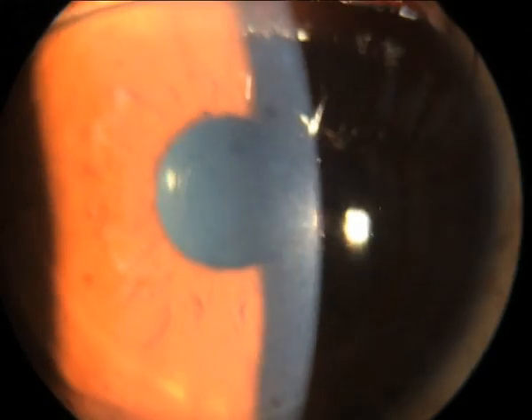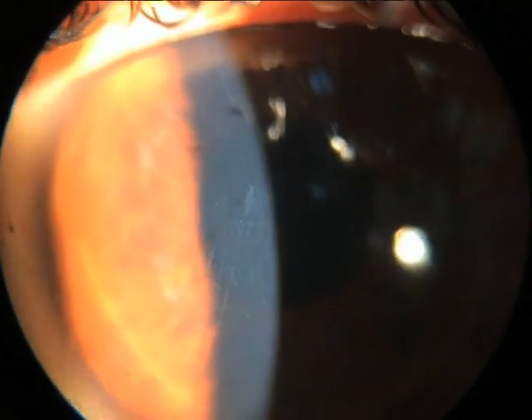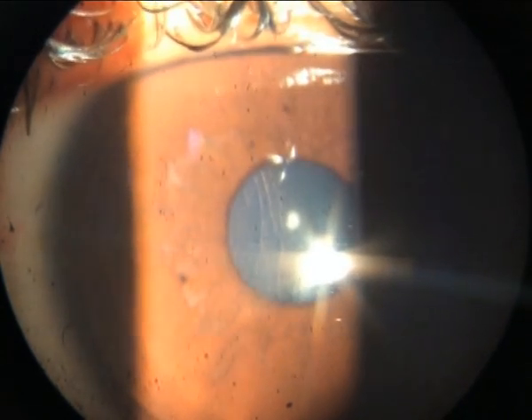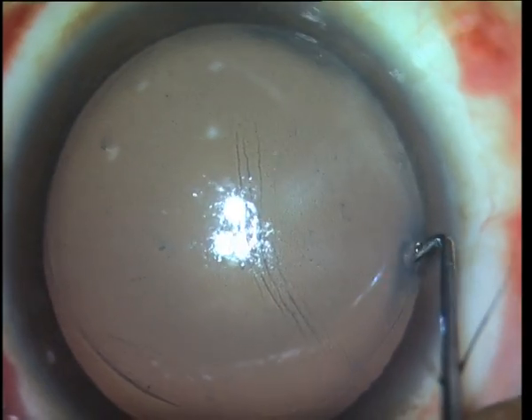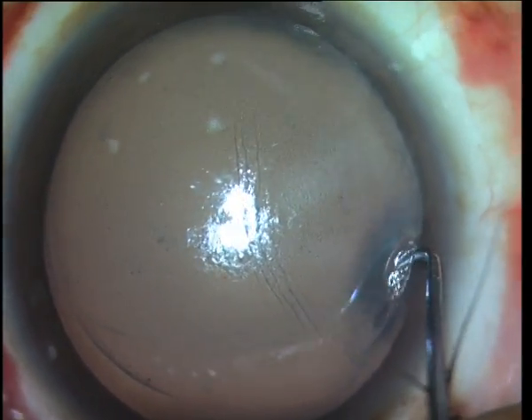Hi everyone, I'm Susan Jacob, and this is the first post-operative day appearance of a patient following IntraLase with a 100 micron flap. You can see these visually significant flap macrostriae which are straddling her pupillary axis, and she did have visual symptoms with glare and decreased visual acuity.